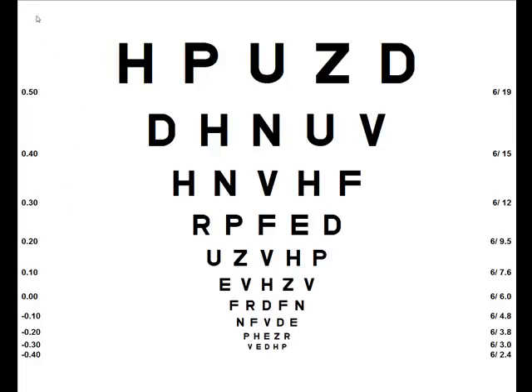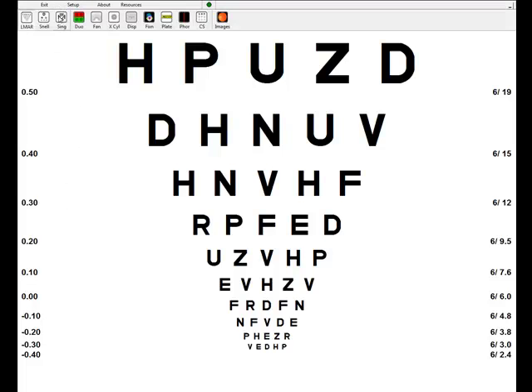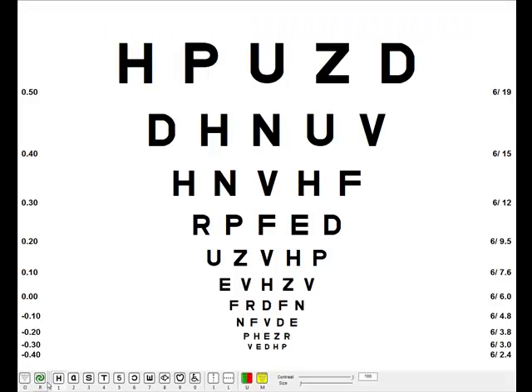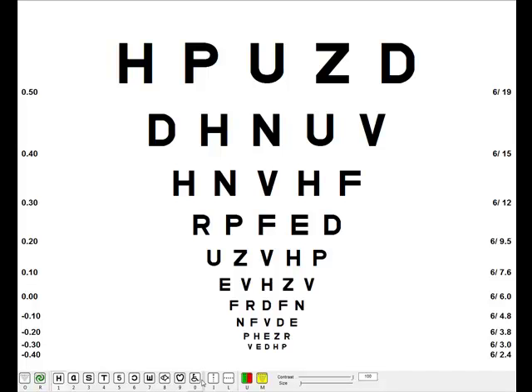If you want to use the keyboard to control the program then each of these primary modes can be selected using the function keys on the keyboard. Function 1 will be logMAR, function 2 Snellen, function 3 single letters, etc. For the other tests within each mode, the letter underneath each of the icons tells you what buttons on the keyboard will perform each function and indeed on the infrared remote control.